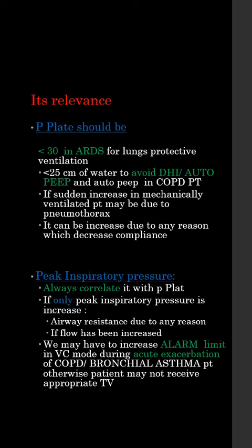So, what is its relevance? The main relevance is in patients with ARDS on ventilation. We have to keep the plateau pressure less than 30 for lungs protective ventilation. In a COPD patient, to avoid dynamic hyperinflation, we have to keep it below 25 centimeters of water.